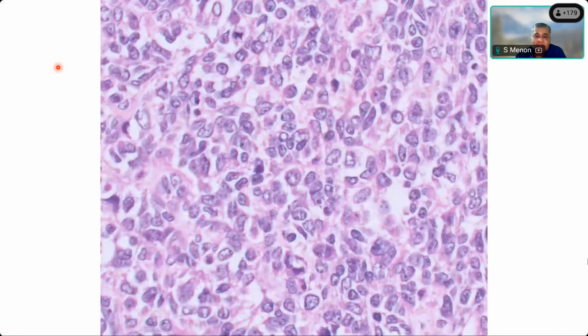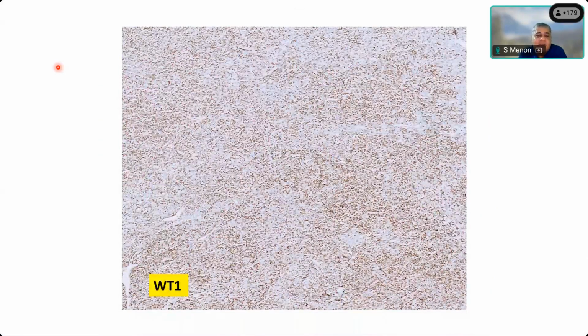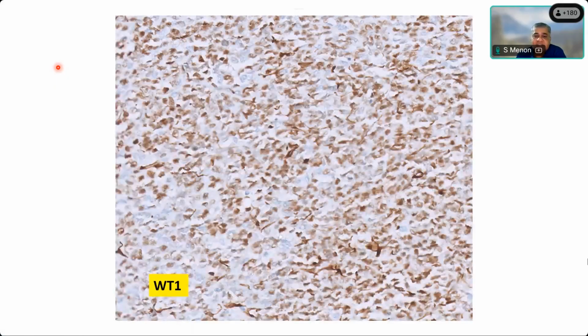Granulosa can be positive for WT1. Very good. So mind you, sex cord-stromal tumors of ovary, especially Sertolis, can be WT1 positive. DSRCTs are WT1 positive. Many gynae tract mesenchymal tumors can be WT1 positive, especially some leiomyomatous tumors, especially uterine leiomyomas. Fibrothecomas, all sex cord tumors can be WT1 nuclear positive. So this is your WT1. It is decently positive, I'll say, in the nucleus.